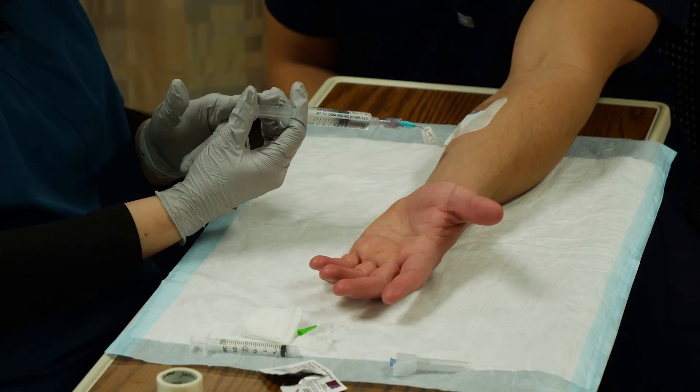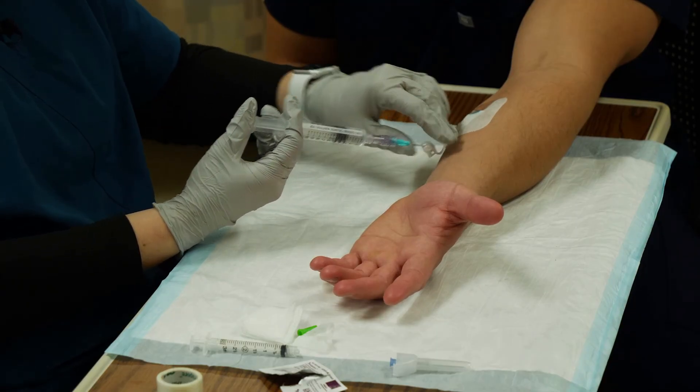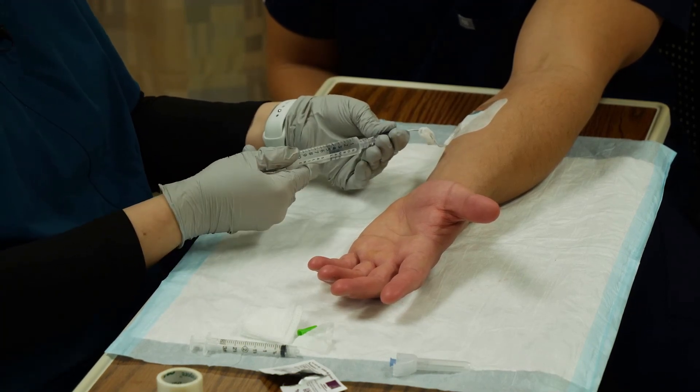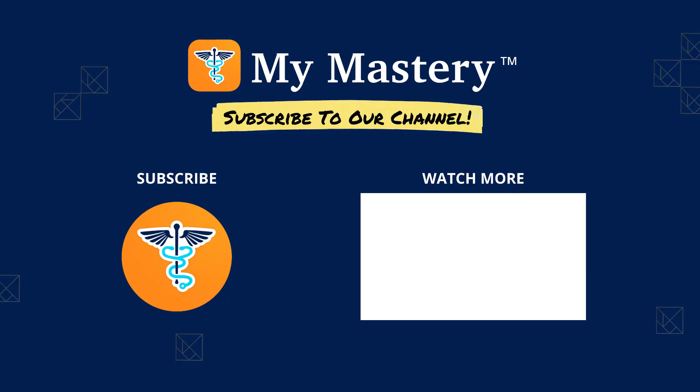Now I want to make sure that this vein stays patent after I'm done. Once I'm sure the medication is through the tubing and in the vein, I'm going to give this a slightly more aggressive push to make sure there are no clots in here. While I have my thumb on the plunger, I'm going to clamp this, which maintains the pressure to help prevent clots at the end of the catheter. If I have a disinfection cap, I would put that on here now.